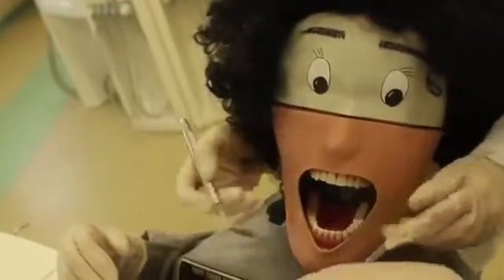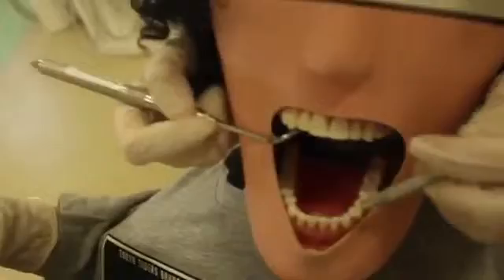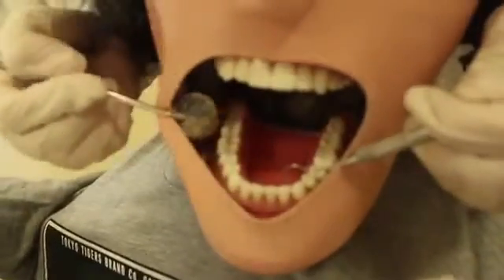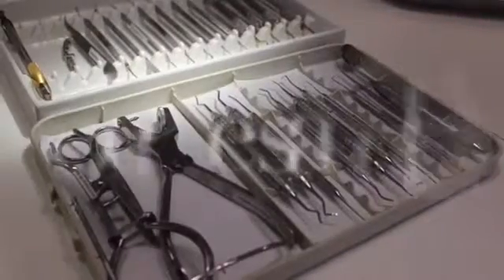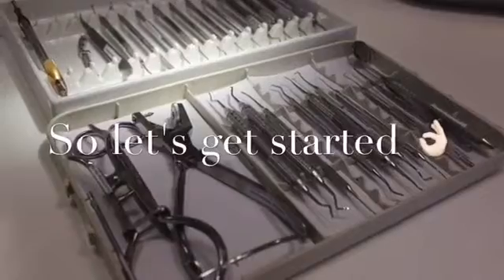His dentist used a mouth mirror and an explorer to locate caries in his teeth. During clinical examination, Class 1 caries were found on tooth number 46. So let's get started with the procedure.